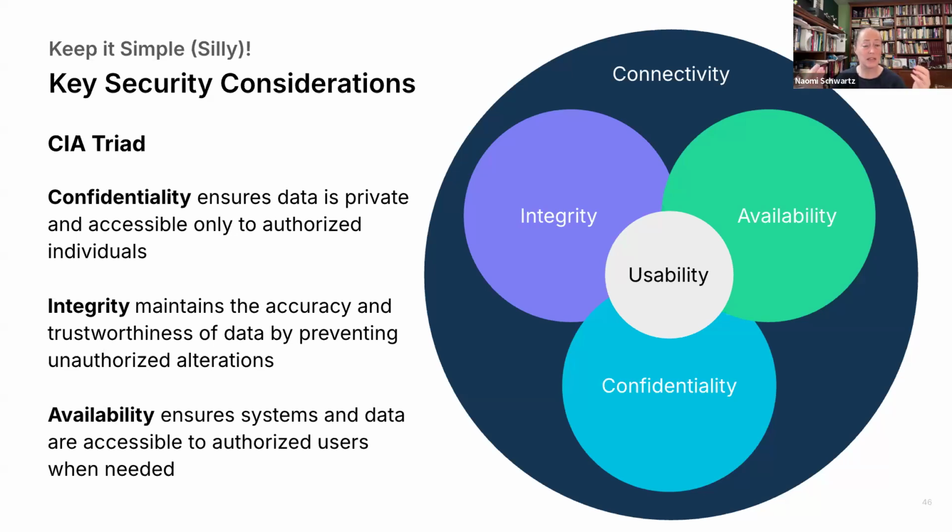For anybody who was affected by the AWS server outages earlier this week, you know that availability is actually a really big deal. People say, oh, well, it's just AWS. It's AWS, which causes your Ring doorbell not to function, which causes DoorDash and other services to go down. It is a cascading problem. And when we talk about availability, I want a fail-safe mode. I want your device to say, well, I don't have wireless connection right now. I'm going to keep functioning in some safe state while I wait for this to recover. Operate through is really critical.